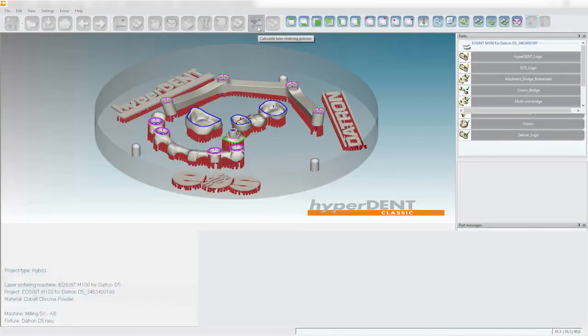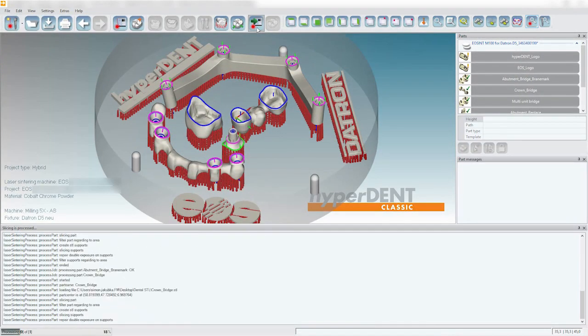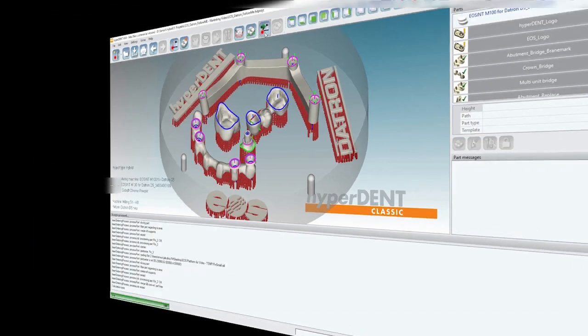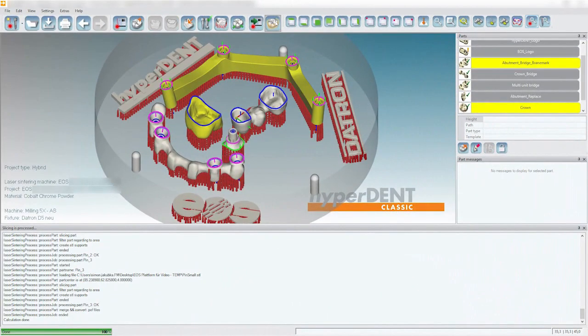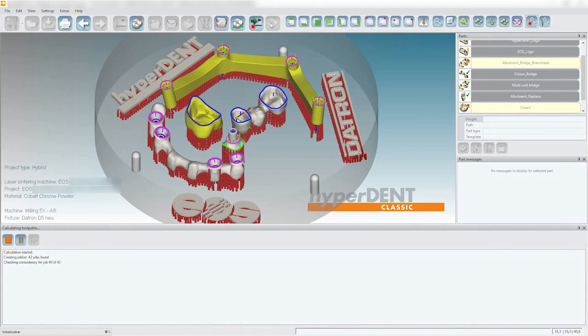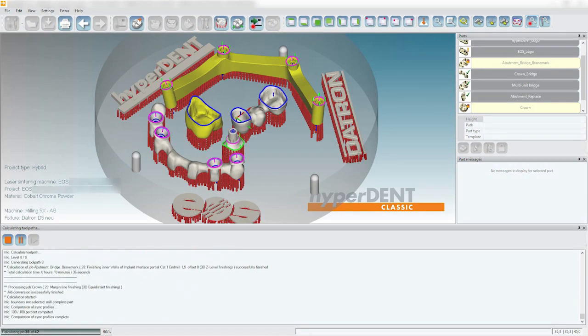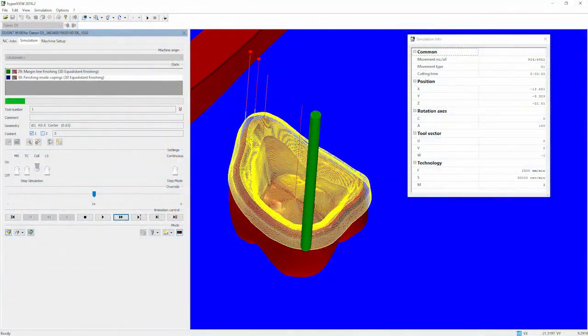Once all has been set, simply create the slice file for your EOS machine. Now generate the NC code for your Dotron machine. The part offset for post-milling will be generated automatically. If you want, you can simulate the toolpath as well.